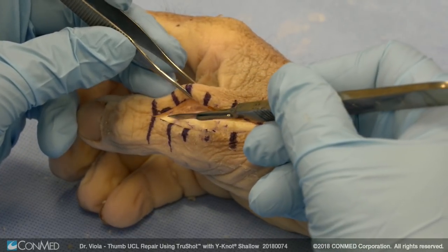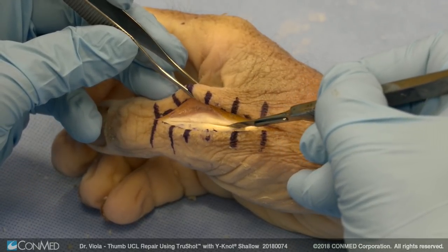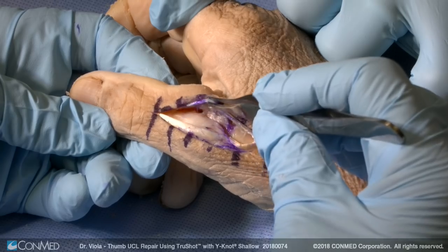The approach I prefer to use is a longitudinal split. I think the tendon opposes better and it's very simple to repair a longitudinal split in the EPL tendon, whereas repairing that sagittal band is difficult as the tissue is flimsy. We split the EPL longitudinally.